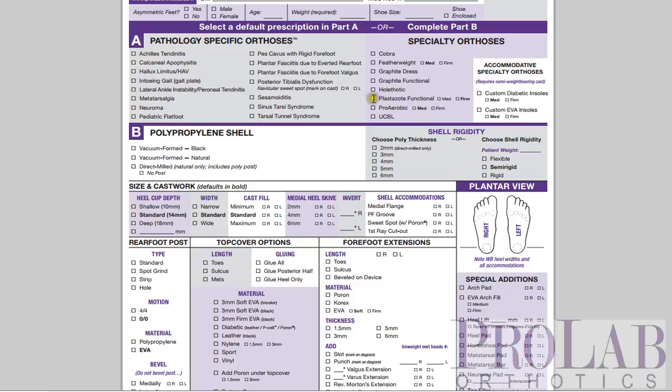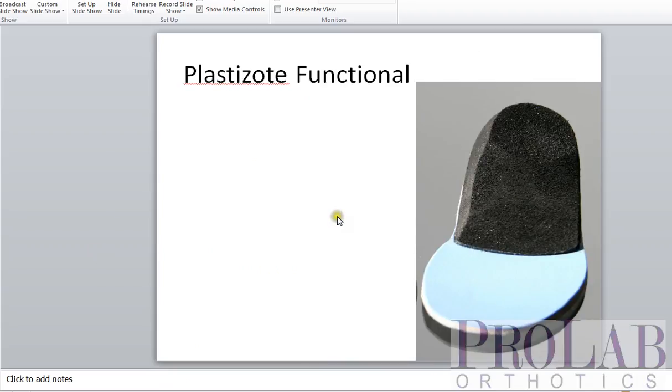Our next device is the Plastazote Functional. This is actually a really nice device for runners — very lightweight yet supportive. This is a firm black Plastazote with a cushioned top cover. This firm Plastazote holds up very well. It won't last as long as a polypropylene device, but it will last a couple of years usually. A lot of runners like it because not only does it give great support, it's extremely lightweight.